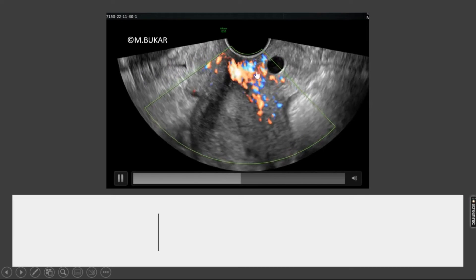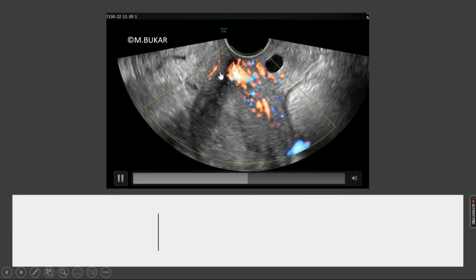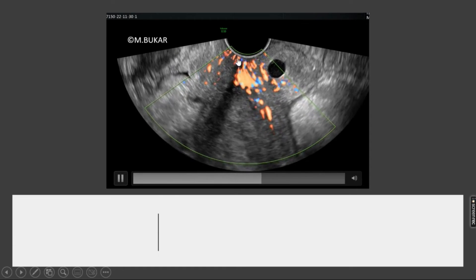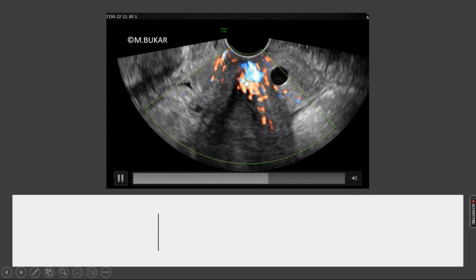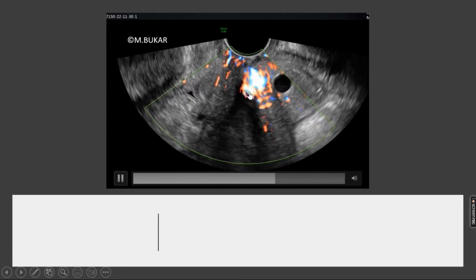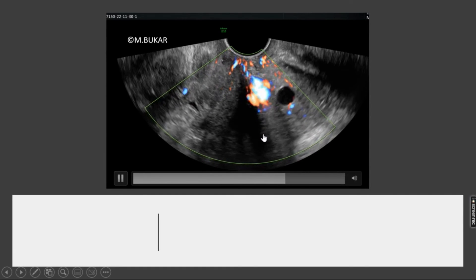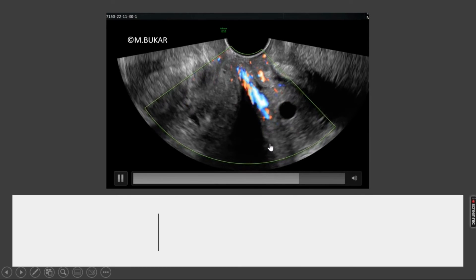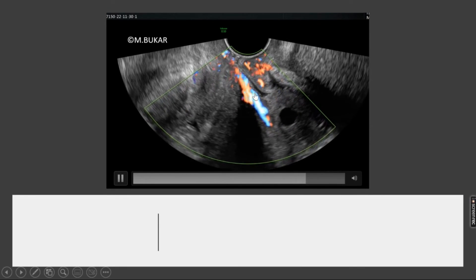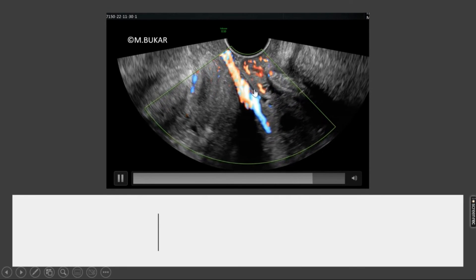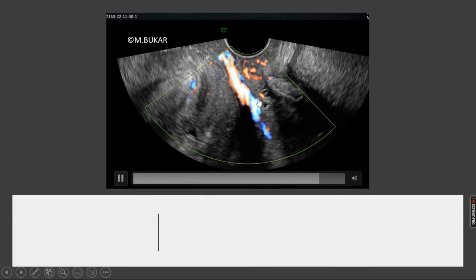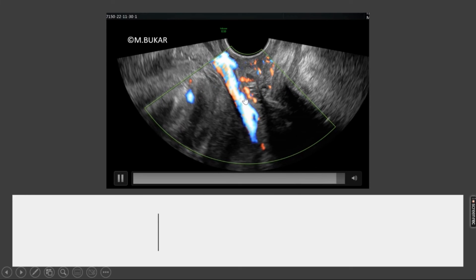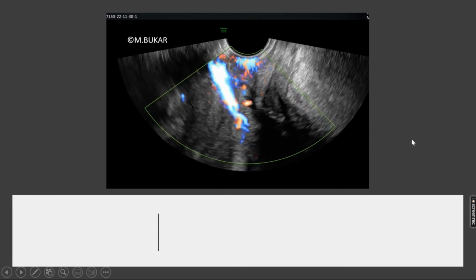And there you are — this is the posterior lip of the cervix, anterior lip of the cervix, and the pedicle is here with its flow. One can trace the feeder vessel up to the lower corpus and down to the introitus. Note the fluid collection within the vagina. And there is the feeder vessel. Thank you very much.